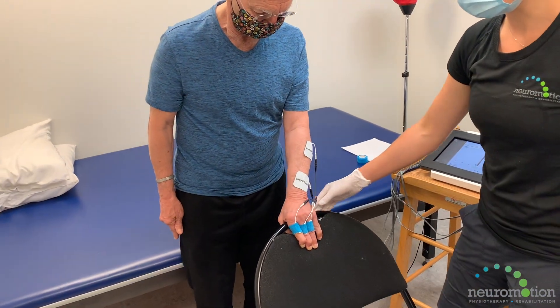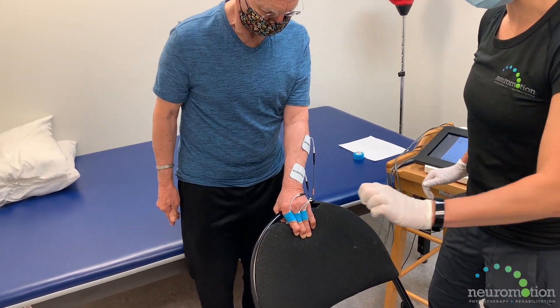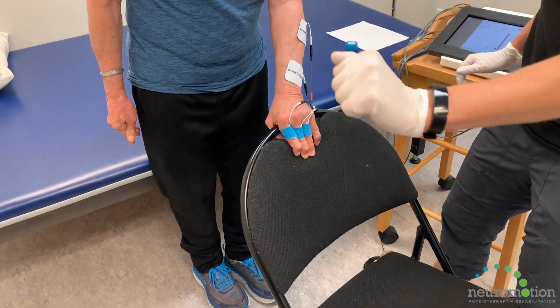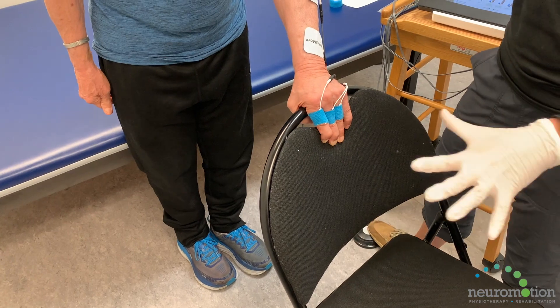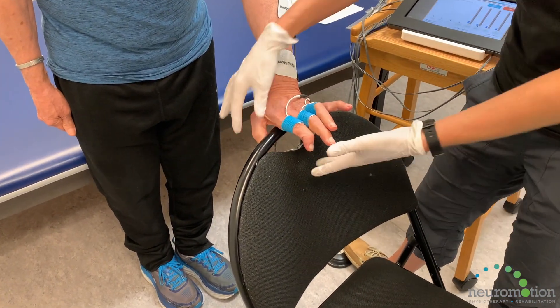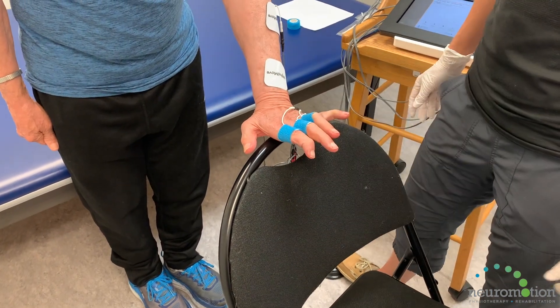Clients do need to have cognitive awareness to be able to participate in the session so they can assist with the movement while doing it. They're getting a signal from the electrodes onto their skin to get the muscles going, and by voluntarily moving with the machine they're also sending a message from their brain to their muscles. This helps with neuroplasticity and creating new pathways in the brain.